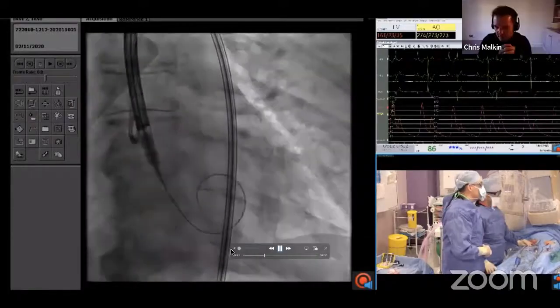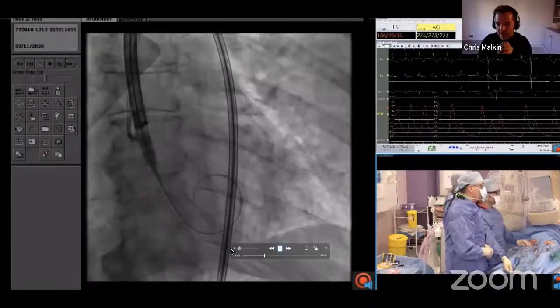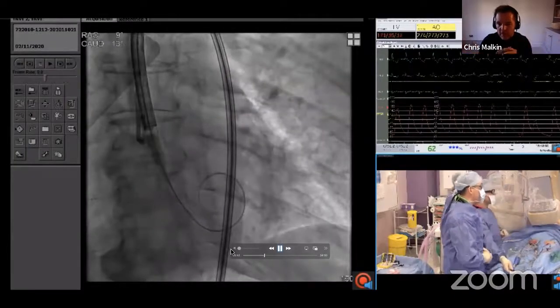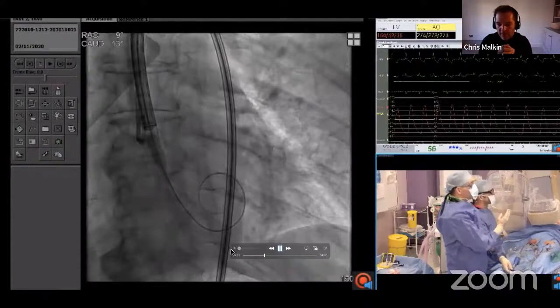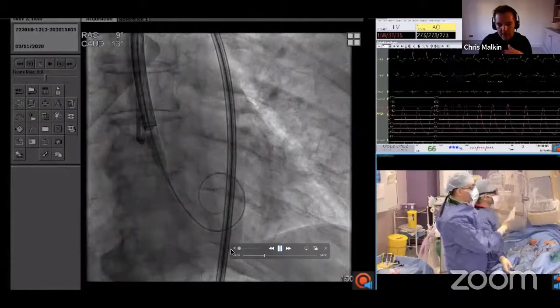Let's turn the volume off. So if you look at my hands there, I've got my left hand on the front of the delivery catheter, and I've got my right hand on the wire. This gives really fantastic control of the valve and allows me to exert pressure both on the catheter and the wire. That can be very important.